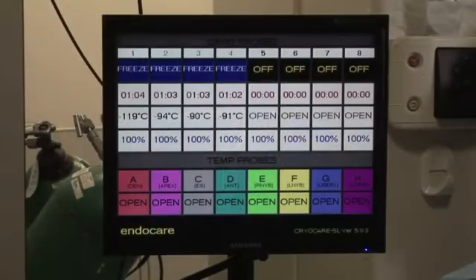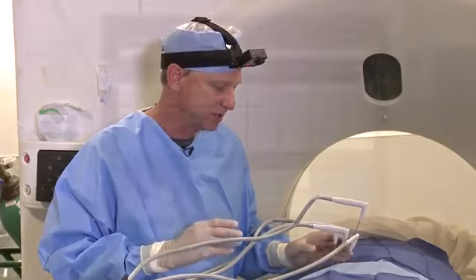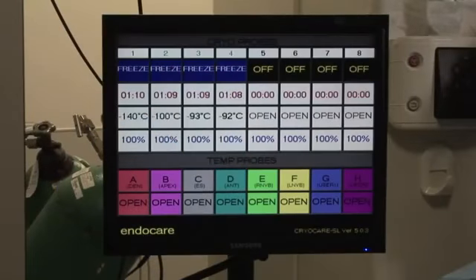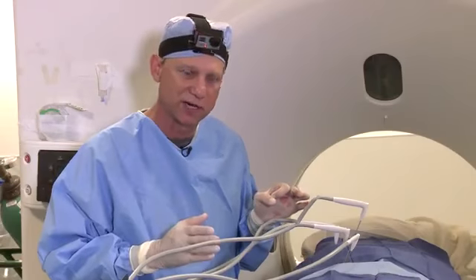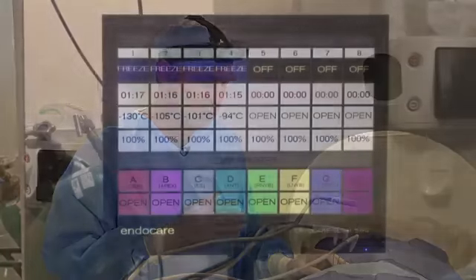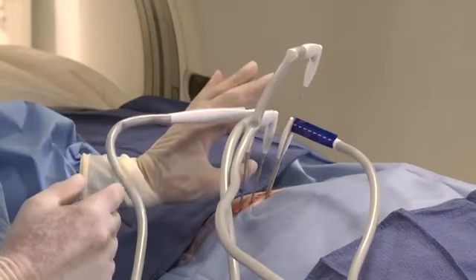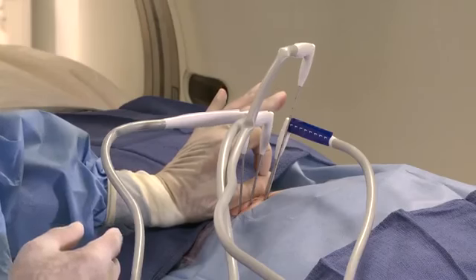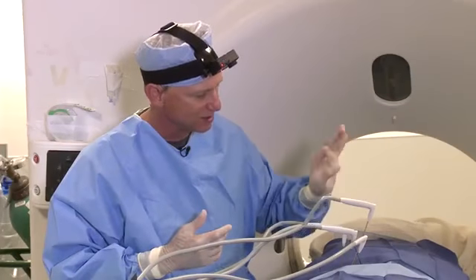We could have done this case with 2 probes had the axis been different. Most of these lesions, virtually all of these above 2 centimeters, have a long axis. And again, your ice has a long axis. So if you can work your probe down the long axis, if the long axis were in this direction on this case, we could have just put 2 probes down that long axis and we'd be done. So just the fact that it's like this instead of like this cost us a lot of time and 2 probes, but that's what it called for.